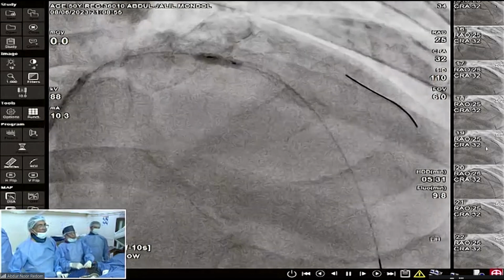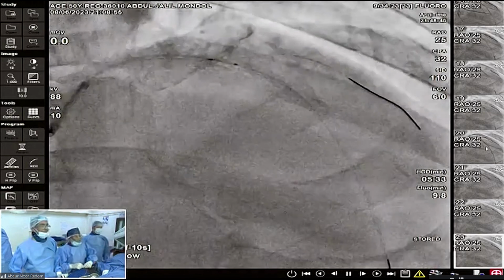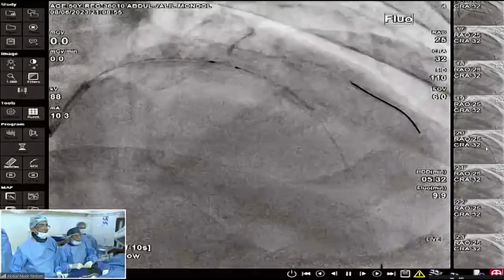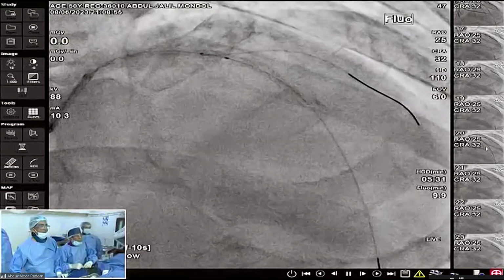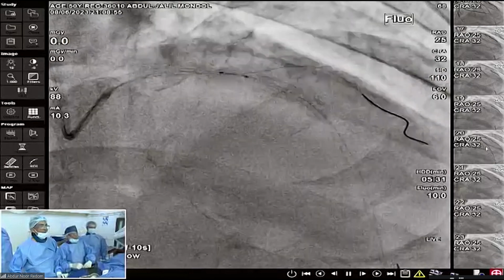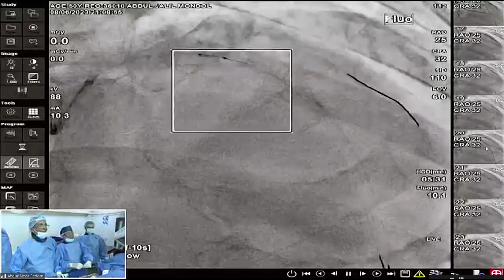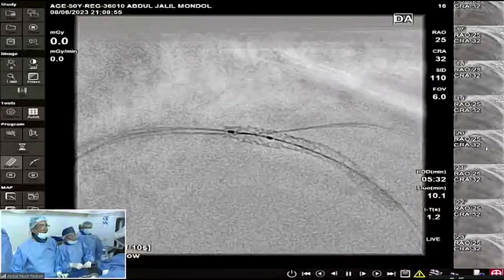Yesterday, some of our speakers showed that the Synergy proximally has a 4 connector, and distally there are 2. With 4 connectors, it will expand better with good radial strength. The reason they have 4 connectors is because longitudinal foreshortening used to happen with the 2 connectors.